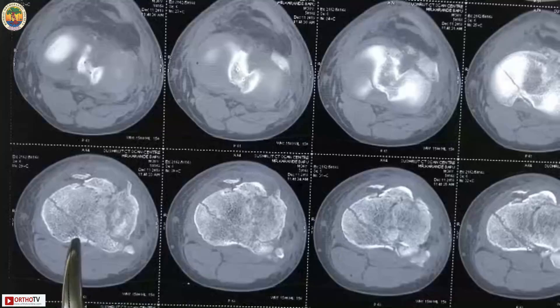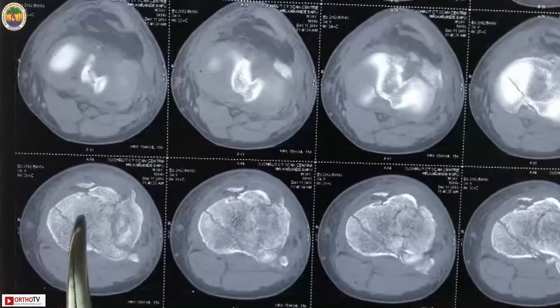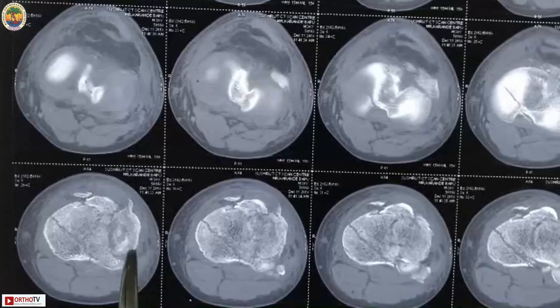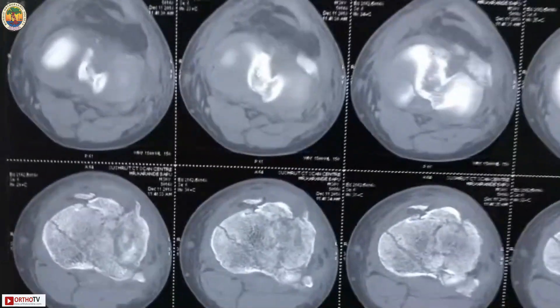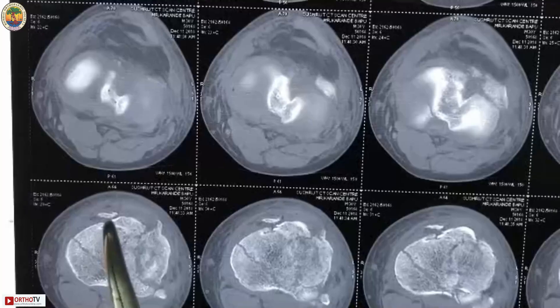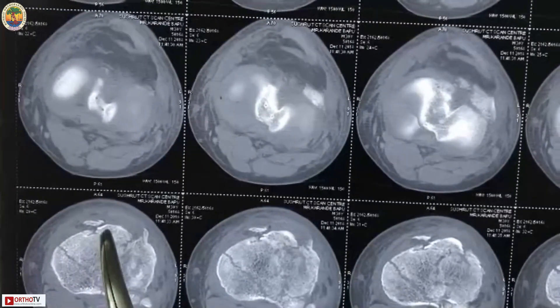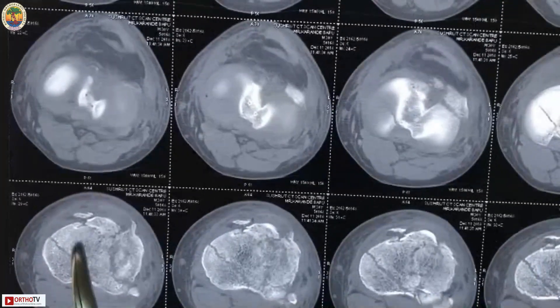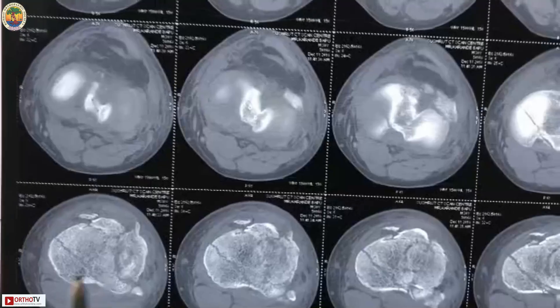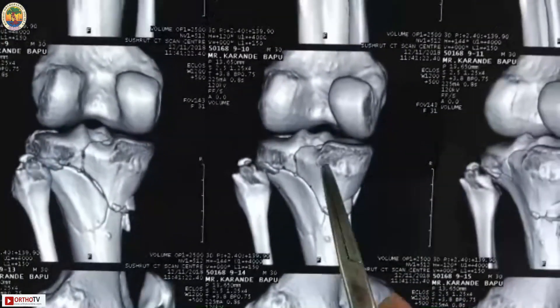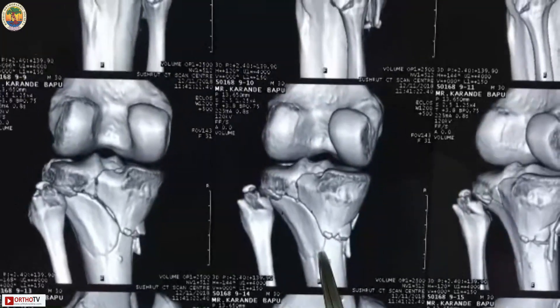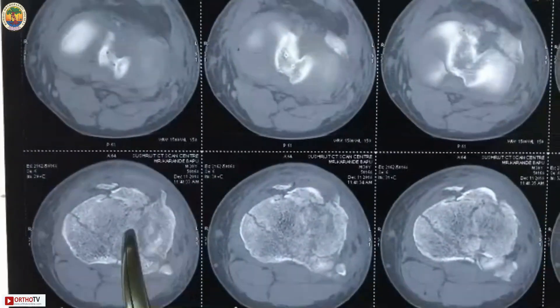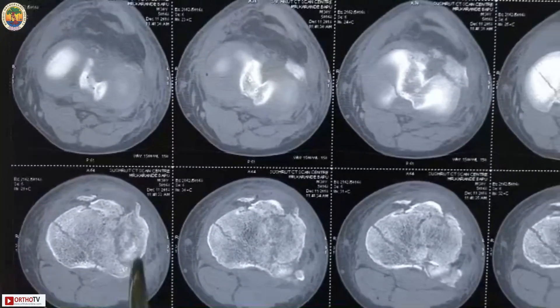On axial cuts, the medial condyle fracture shows a posterior fragment and an anterior fragment, along with a lateral condyle fracture. The plan is to reduce the fracture with a towel clip, place a temporary K-wire, then fix with one screw anterior-to-posterior or posterior-to-anterior. Once both condyles are fixed as one piece, the medial condyle will be plated with a buttress on the posterior medial border, and the lateral condyle fixed with a raft plate.